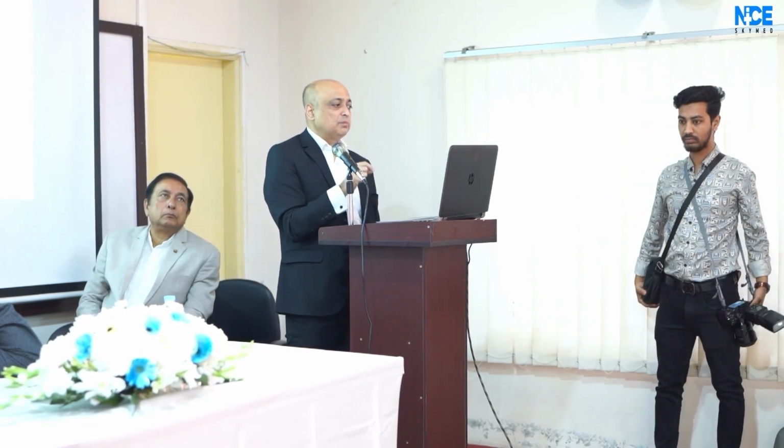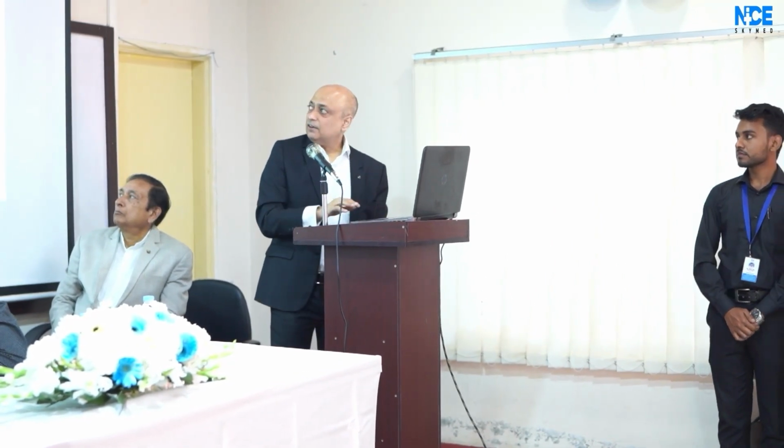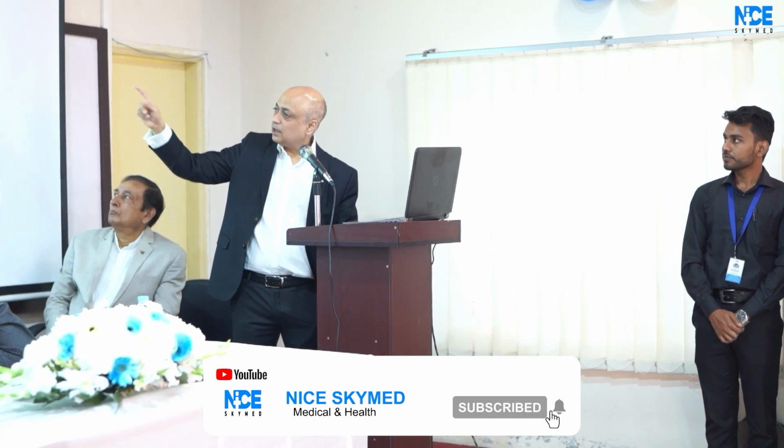This is called the drug-coated balloon, and it is now a class 1 indication for in-stent restenosis. Whenever there is a blocked stent, you just balloon it. After doing IVUS, you just balloon it with a DCB. This DCB deploys medicine over that area, and then you can do away without putting a stent. This is a case I will discuss with you. You see, we are just ballooning that block.